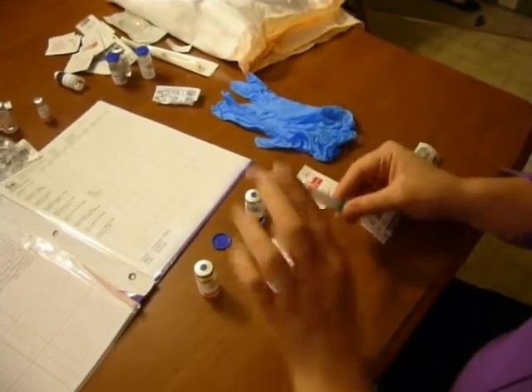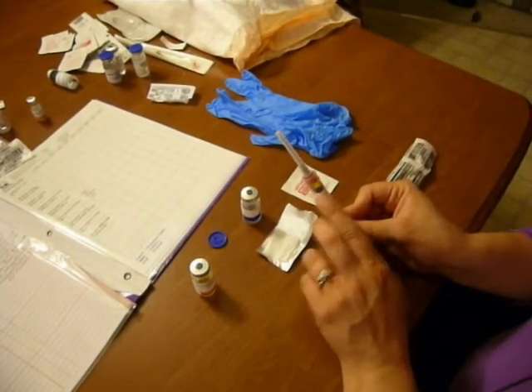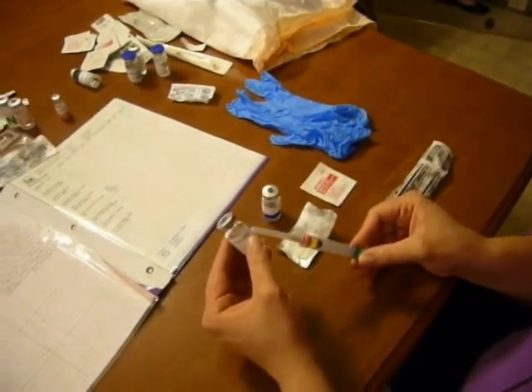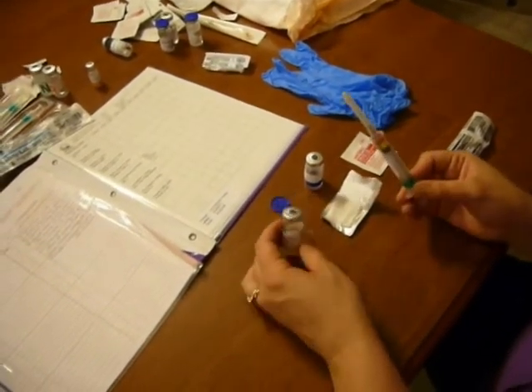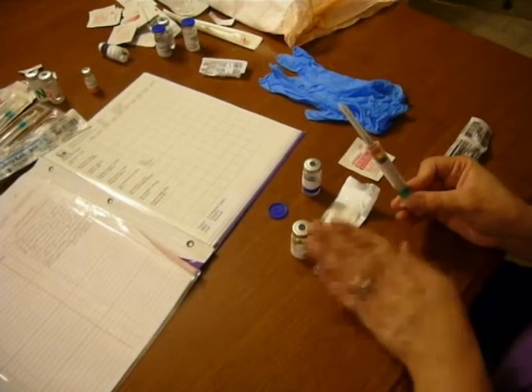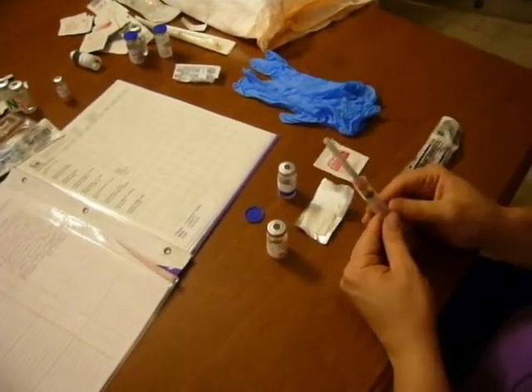Before I go to administer to the patient, one last time I'm going to check — I have 0.5 cc's of medication. Go back and do the math one more time to make sure you did the calculation right and have the right dose. I have 0.5 mLs and I need 0.5 mLs, and that's how you reconstitute a medication for administering parenterally.